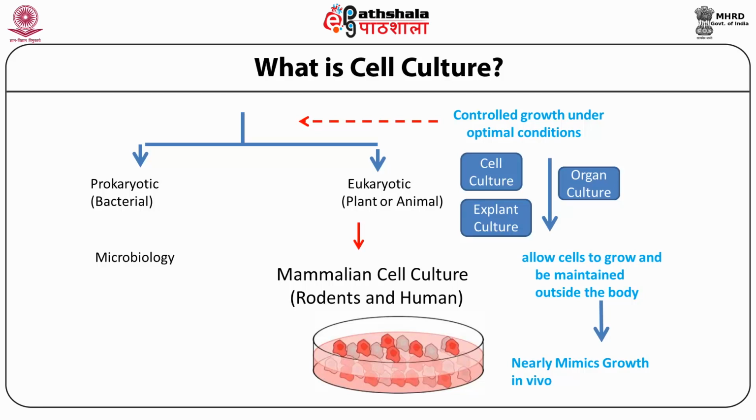During the cultivation of mammalian cells in vitro, that is outside a living organism, some properties are retained as in the original tissue and some functions may be modified or lost with continuous culture. So one has to be careful.